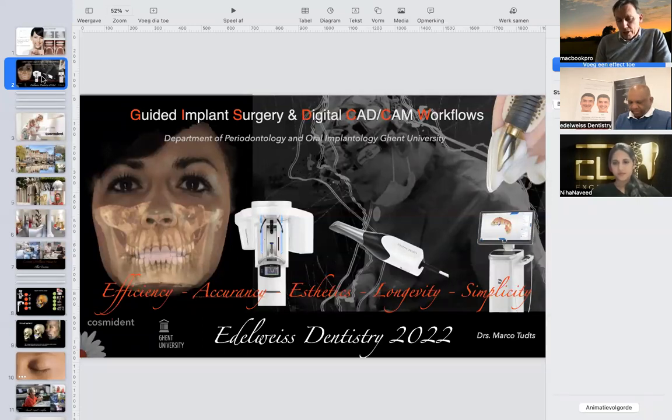And the last thing I hear, but it's not for the moment, perhaps in your countries it's already getting there, is that some companies from the Asia area are bringing new face scanners on the market. I'm very eager to see them and test them, because this will really be the new tool if you want to have something in your office. And it's working very easily, to be honest. It's like a normal camera where you go in front of the face of the patient, and then he can merge.